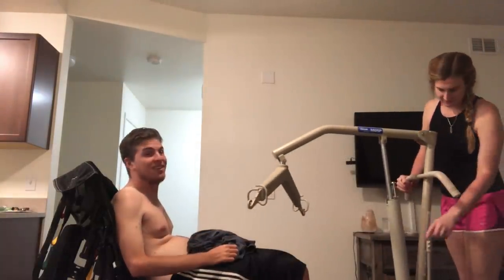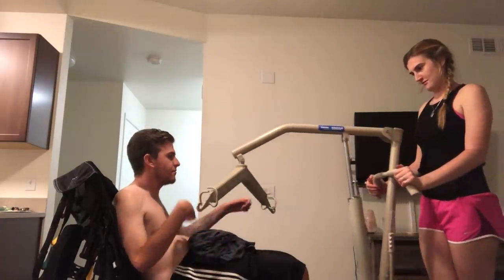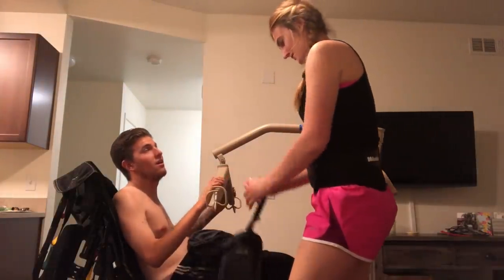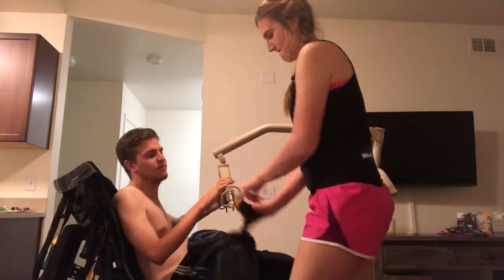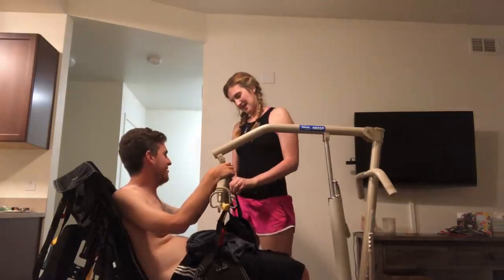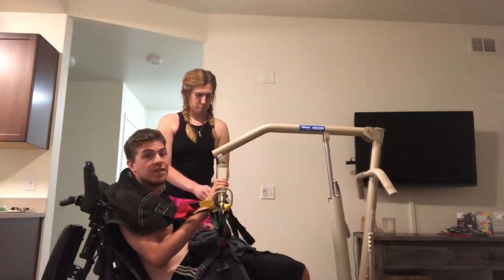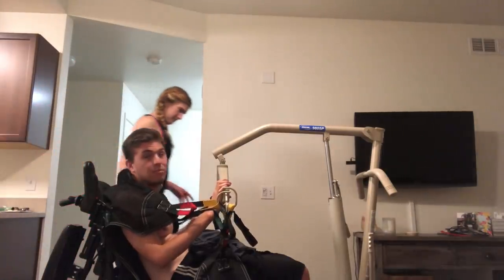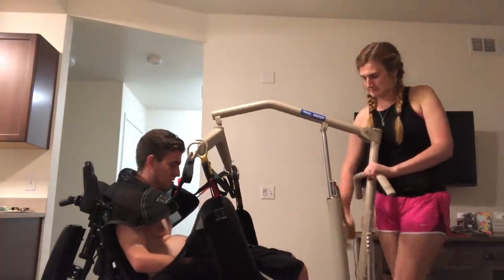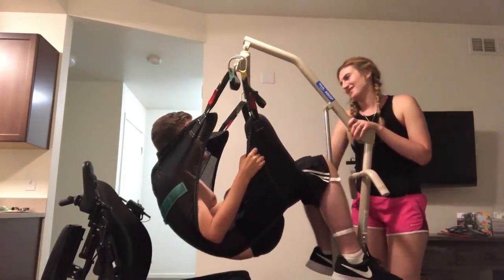There's a little handle on the lift and you have to open it to get around his chair — the legs open up. Make sure it's closed. There are so many different versions. I look forward to this every night — it's like a little ride before I get to go to bed. We've got all four hooks on the same color, which is important. Here we go — and this is like barely any work for me, the pumping. Baby in a sling.